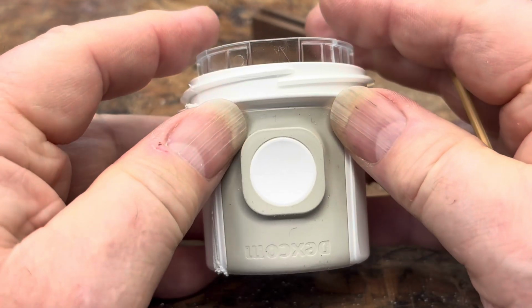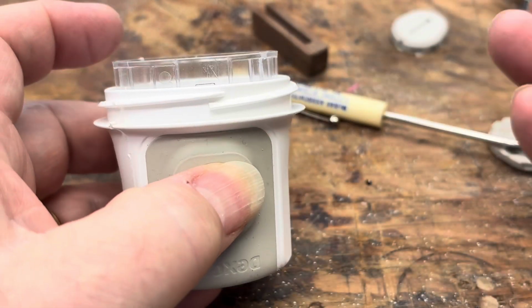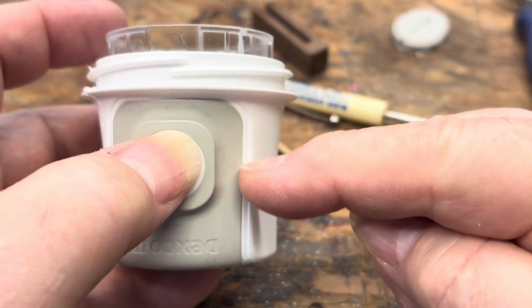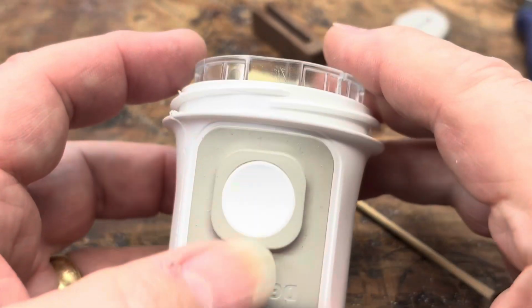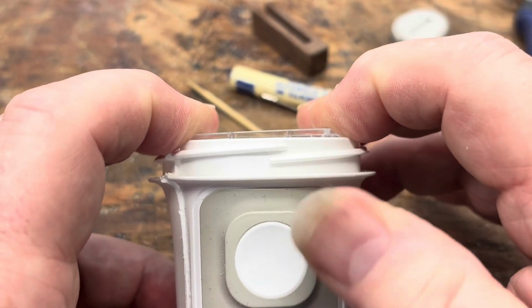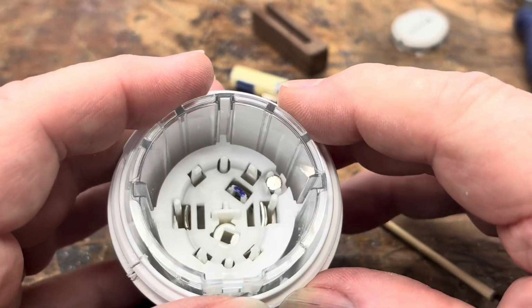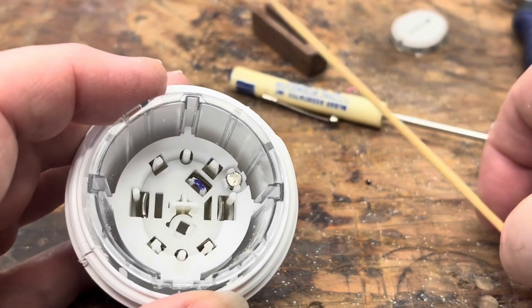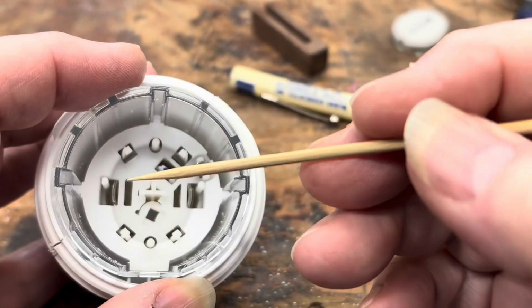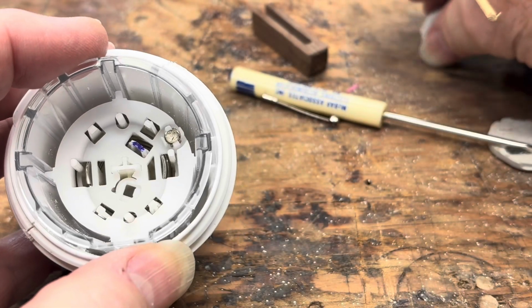Okay, right now the button doesn't do anything because those two springs on cup 2 are holding the latch mechanism away from the button. Now when the user presses this against their arm and pushes the button, the fun starts. The latch on cup 3 is released from cup 2. This 3-4 mechanism is launched towards the user.